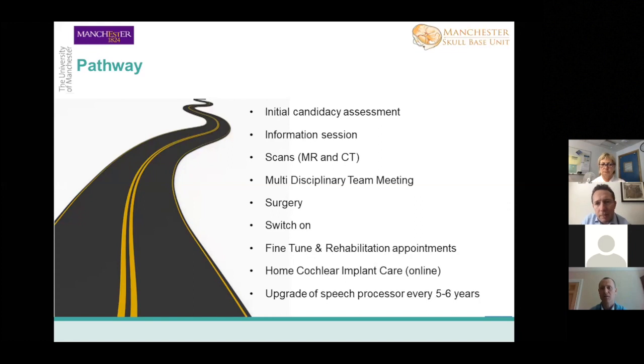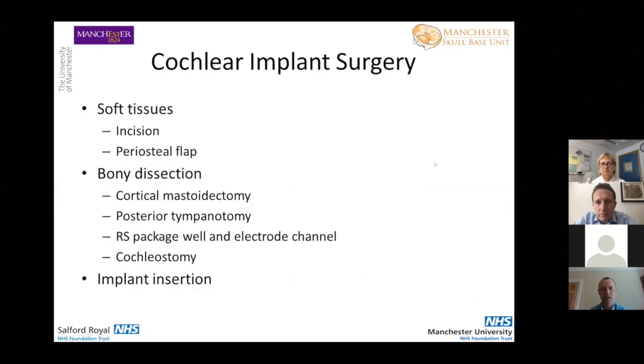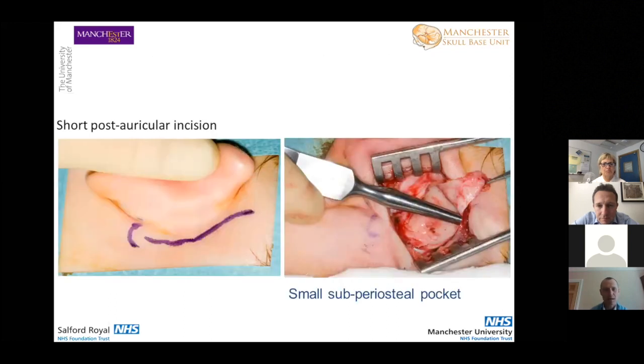Yes. So I've just got a few more slides here. A brief summary of cochlear implant surgery is consideration of what do we do with the soft tissues, what do we do for the bony dissection, and then placing the implant. Fundamentally, the bone dissection is cortical mastoidectomy, posterior tympanotomy. It says cochleostomy here. I hadn't realised that. It's an old slide. It should say removal of the round window niche and exposure of the round window, which is what we do for most patients.